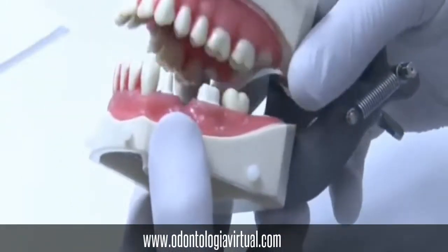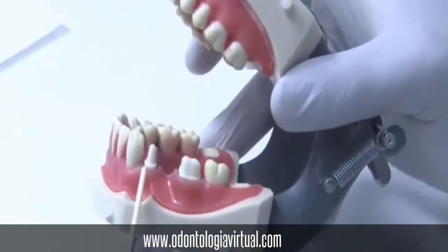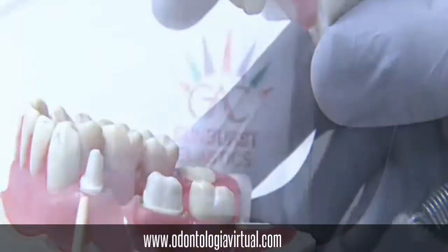Insert the following teeth: number 4, 6, 19, and 21. Make sure that tooth 19 has orthodontic bands.